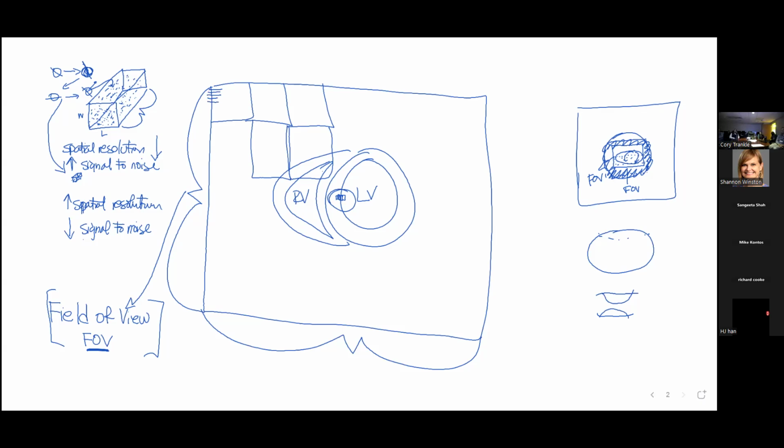This is going to be our dividers, right? How many lines are going to come across here like this, and how many lines coming down this way to make these pixels in 2-dimension or voxels in 3-dimension?